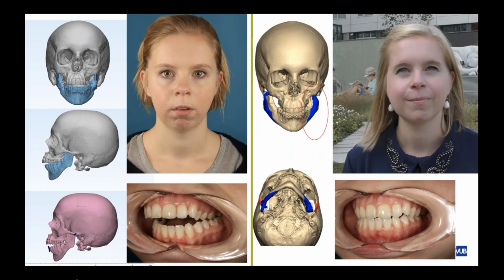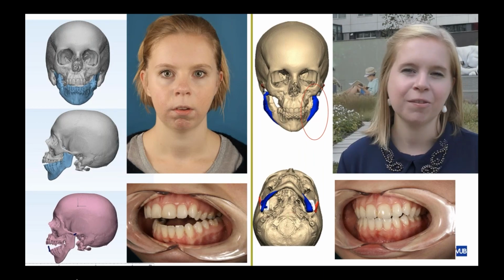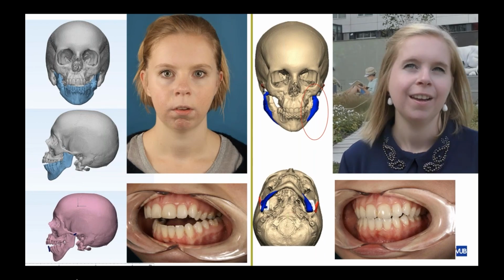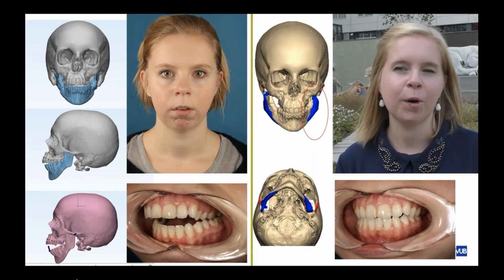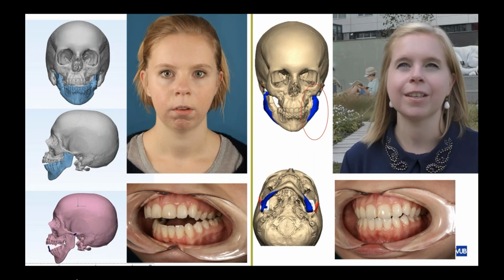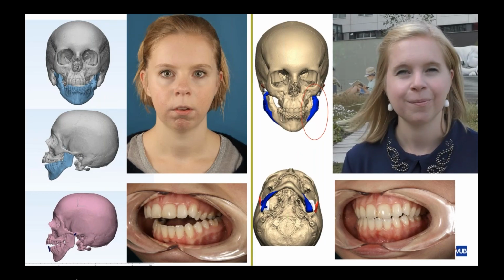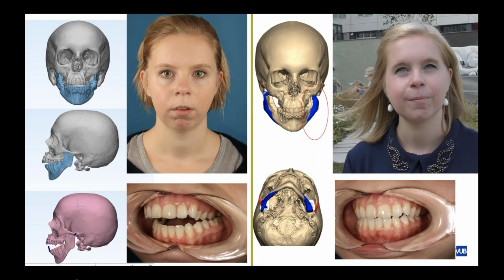Something else, unfortunately, they exist, these patients with obstructive sleep apnea due to condylar resorption after orthognathic surgery. Left before treatment, showing restriction of movements in 4D CT. The patient reported 10 for pain on a visual analog scale between 0 and 10.